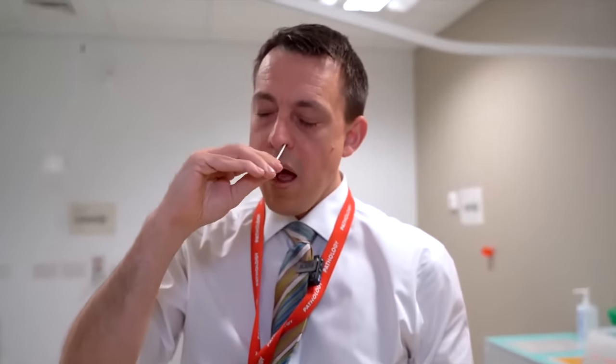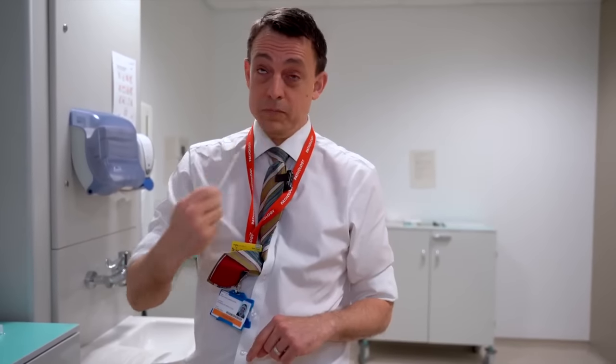Then do the same with the other nostril — right to the back of the nose until resistance is felt, then turned around. It's normal for you to tear up at this point.